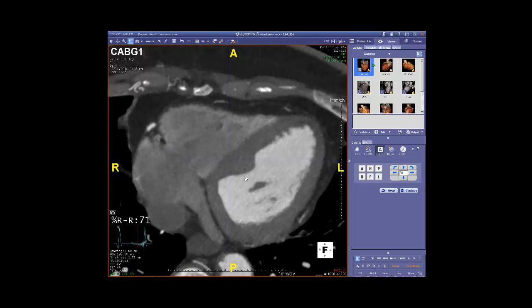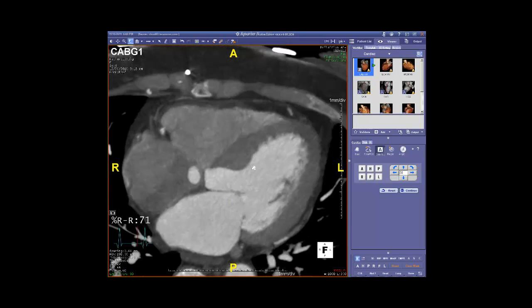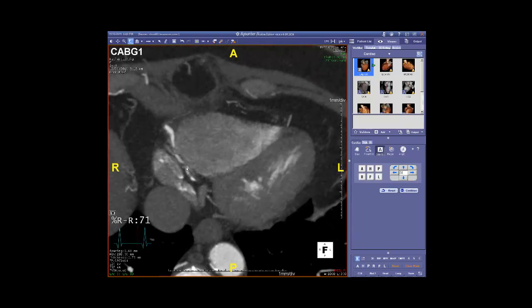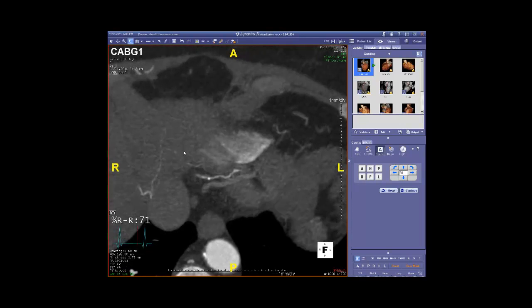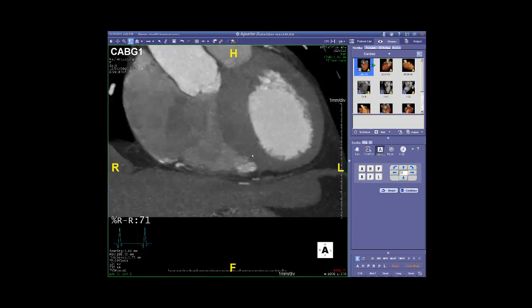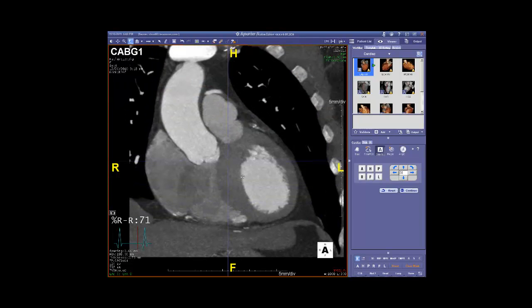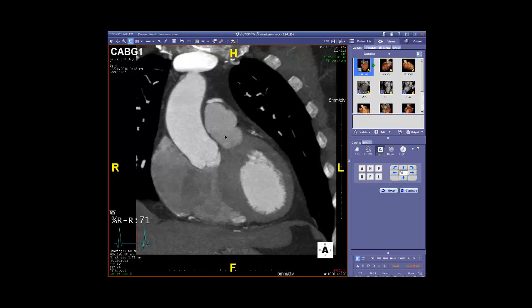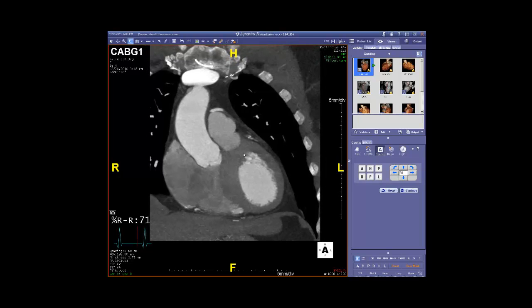Panning down to the bottom of the heart to look at that vein graft — here's that distal vessel, the posterior descending artery extending to the inferior septum, with some severe stenosis here beyond the vein graft insertion site. So we've got disease in the graft itself and disease in the native vessel. This is a really unfortunate lady who's just had open heart surgery. She's got a lesion in the LAD beyond a patent left internal mammary graft, a severe anastomosis lesion in a vein graft going to an obtuse marginal, and a high-grade stenosis in the vein graft going to the right coronary with distal disease in that vessel as well. This patient also ended up needing an angiogram and went on to have stenting of both the vein graft to the right coronary as well as the distal vessel.